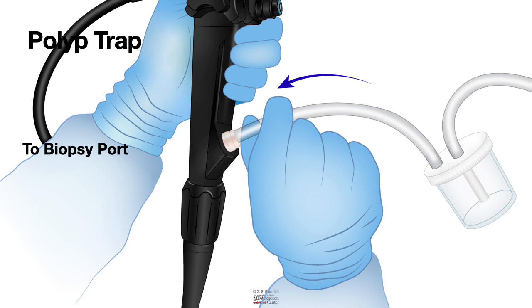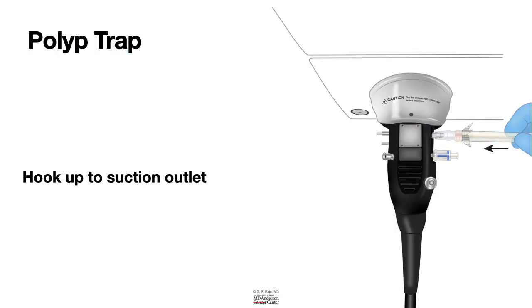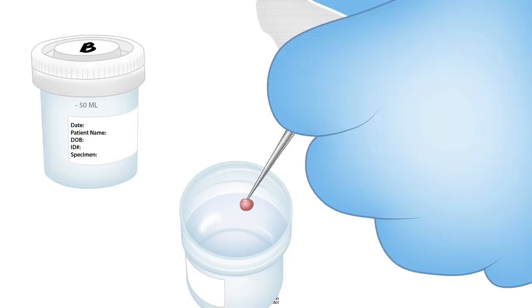Another cheaper way to do this is to put a gauze onto the suction canister's tubing and plug it to the suction outlet, and once you suction, the gauze will trap the polyp, and this way you could avoid or save plastic and may be helpful in limiting unnecessary wastage of plastic. Again, you want to deposit the polyp that you collected into the formalin jar.